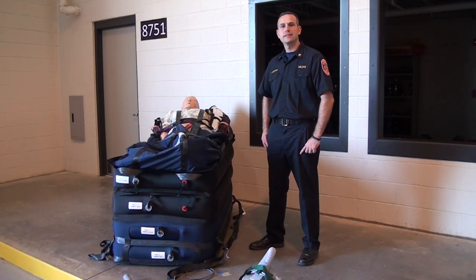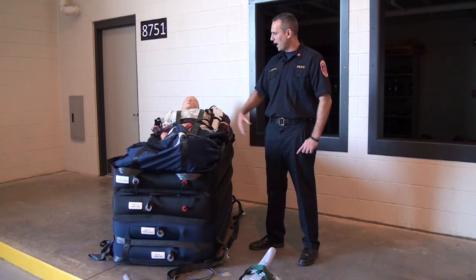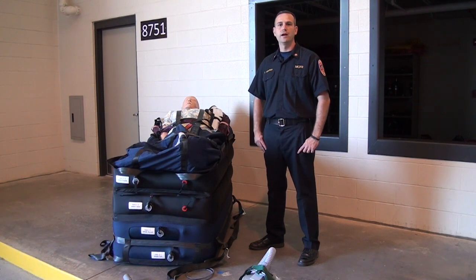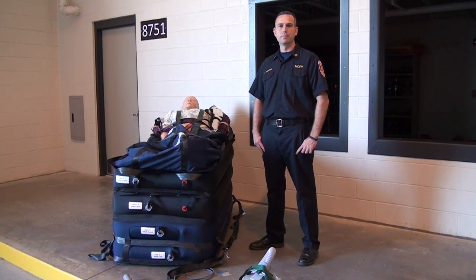This is the hover jack device that is carried at stations 17, 22, and 26. As we saw the patient being transferred with the hover mat onto the device completely deflated, we can then use this device for lifting and transferring patients.